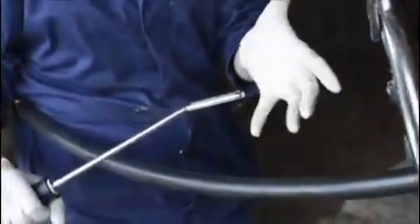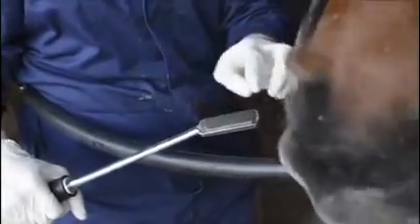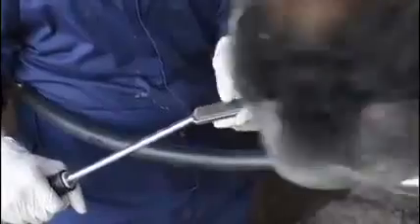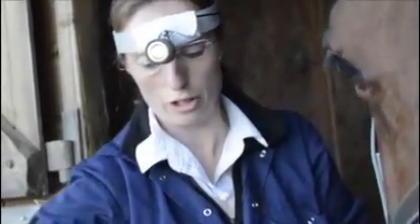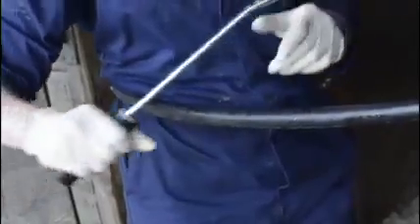Okay, so these are the manual rasps, which is what we always used to use before we had motorised ones. These are lovely and light, they're very thin profile, so there isn't much room between the tooth and the tissues, which is nice and comfortable for the horse. These are made of a solid tungsten carbide and they're chipped in the surface, very very sharp but nice and smooth and easy around the shaft, just to get to different areas of the horse's mouth, so we have different shapes that we use depending on which area we want to rasp.